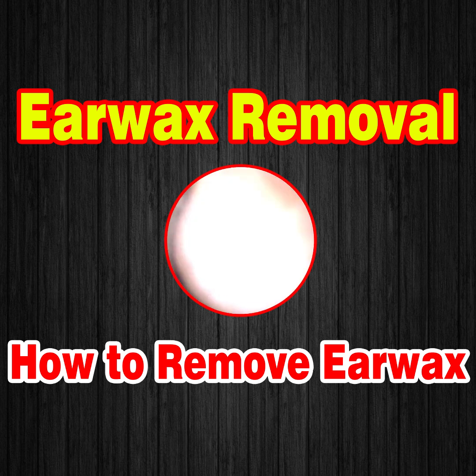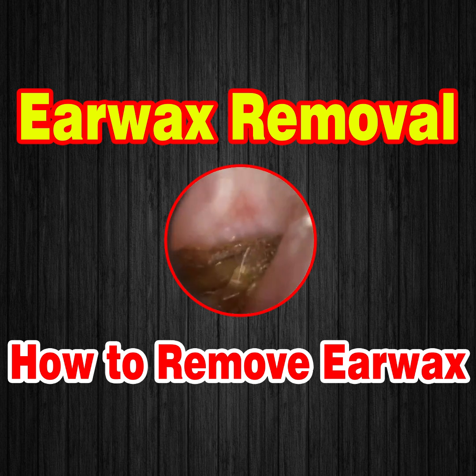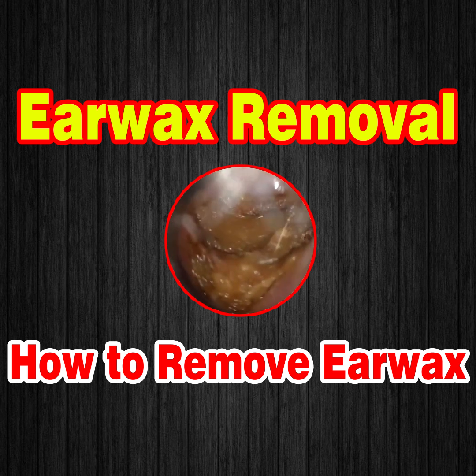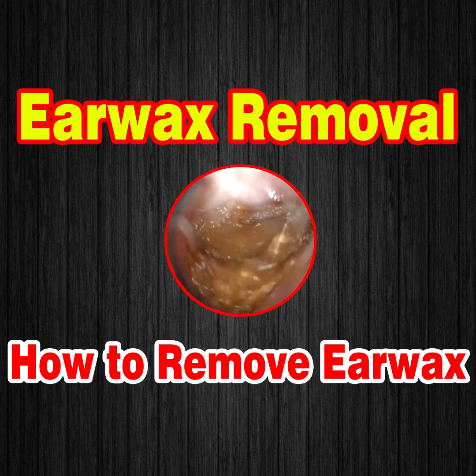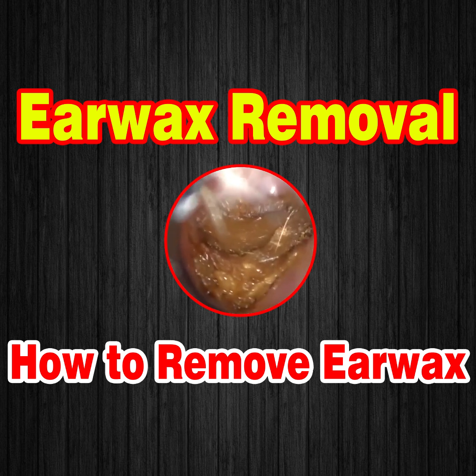So a lot of people really struggle to get the grip and keep the hand stabilised. So yeah, the ENT surgeon, to get access into the middle ear, they have to chisel away a tremendous amount of bone. And that's because the bone is not flexible. If you've got a bendy, twisty ear canal, it's a bit difficult.